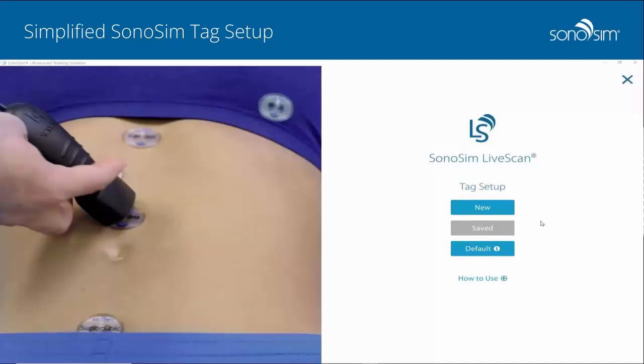the tags. And you can choose a default feature. So as we play, you can choose a default feature, and that'll set to factory standards. And a majority of the time, those default features work fine. But once again, if the body morphology of your real patient or your mannequin is different, you can customize the tags and the internal anatomy to align with whatever model you're applying to.